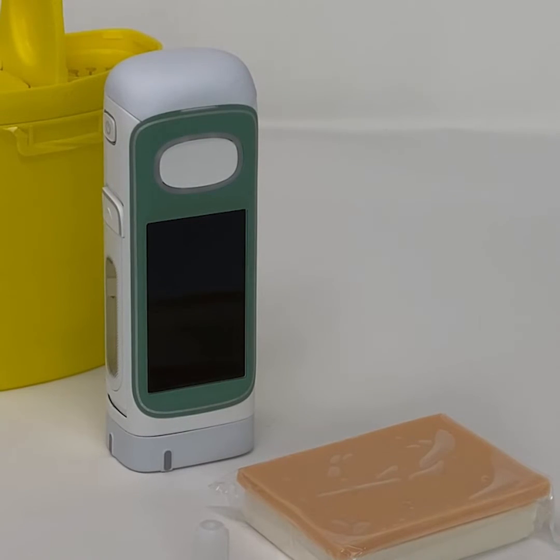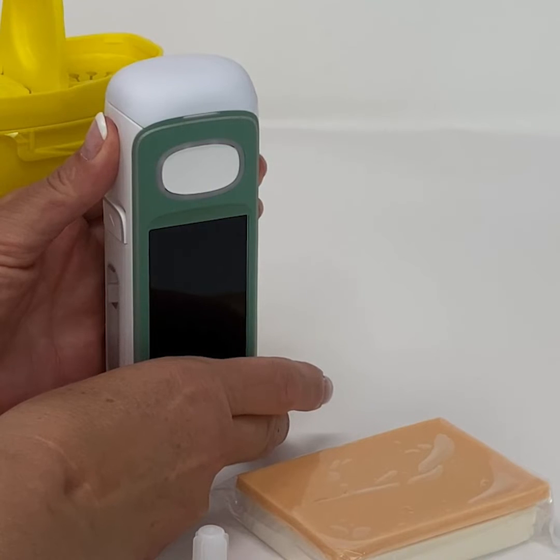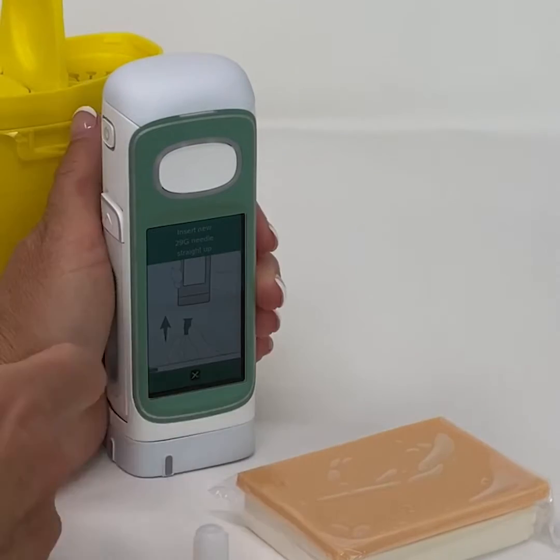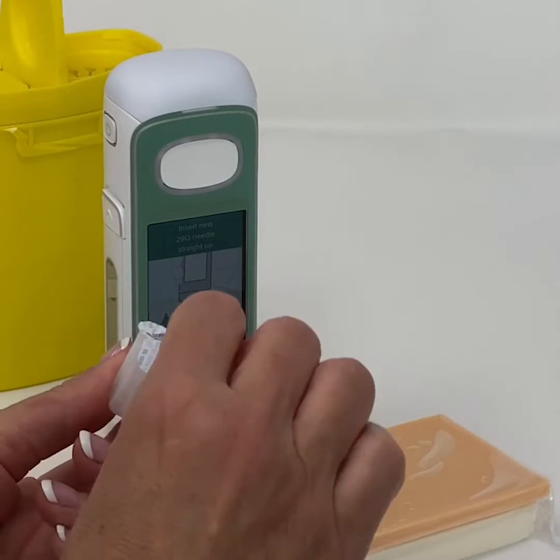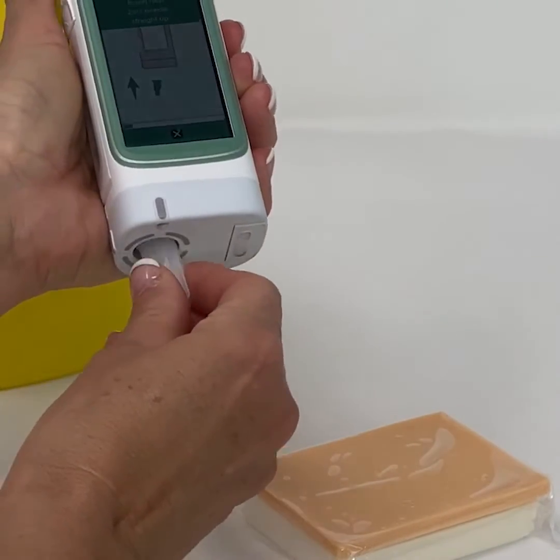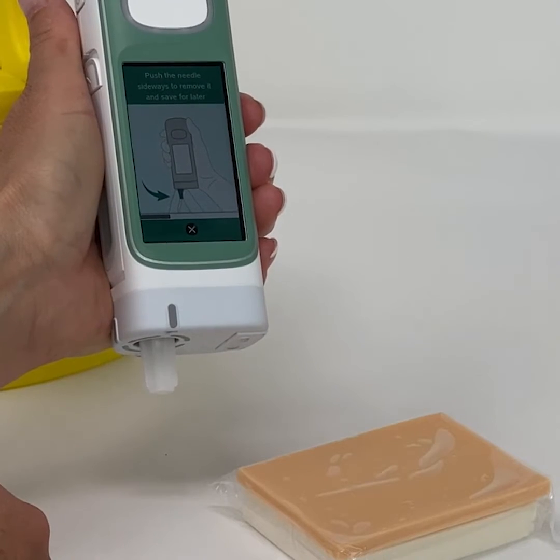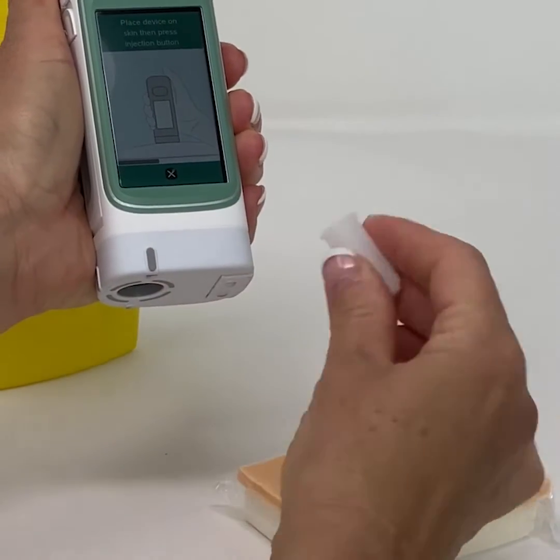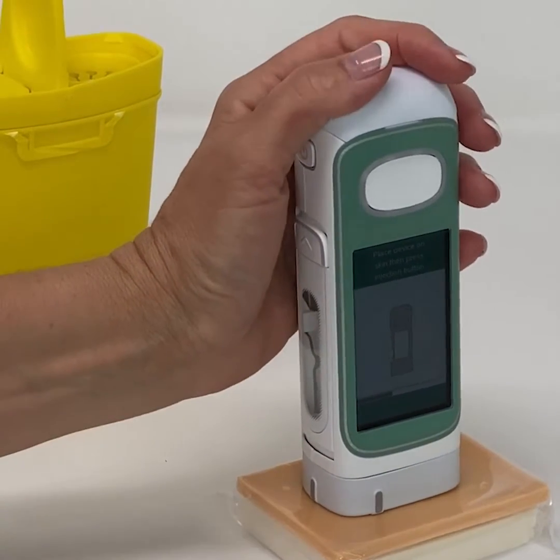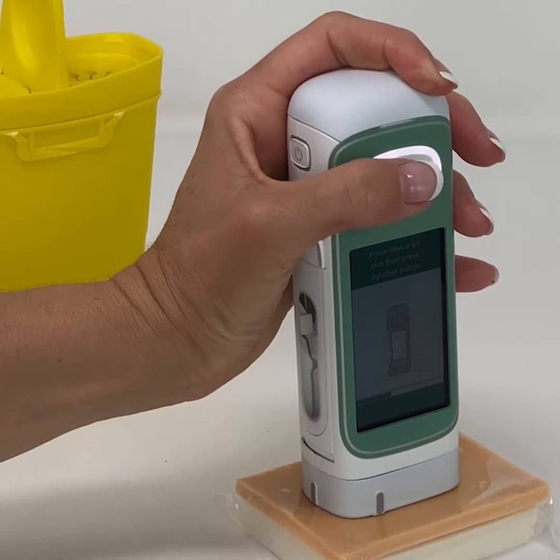To perform an injection, press and hold the on-off button until the display switches on. After a few seconds, the home screen will appear. Press the on-screen injection button and insert a new needle — first remove the paper seal and insert it into the device as shown. Wait for the needle attachment, then remove the needle cap. Press the device against the skin, making sure the skin sensor comes in contact with the skin. The white light around the injection button will illuminate white.